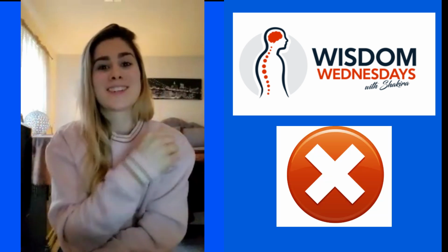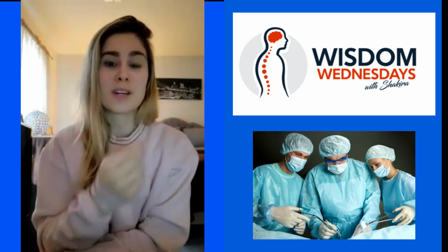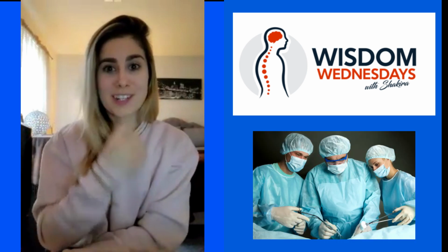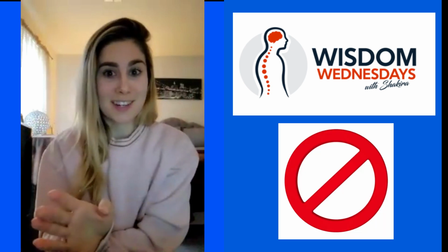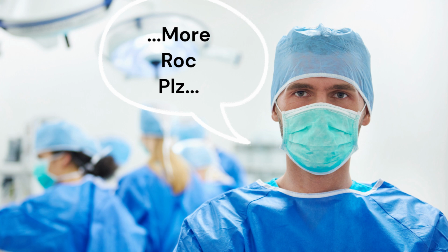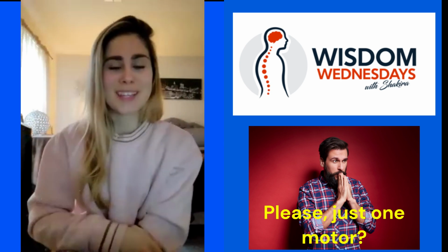Why? Because your cardiothoracic surgeon is going to do a sternotomy. Does he want any chance of movement during a sternotomy? Absolutely not. So you're going to be paralyzed during almost the entire surgery. So paralytic's going to be on. So how do you still try to squeeze some MEP in?